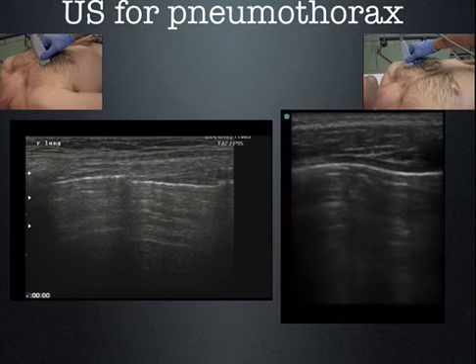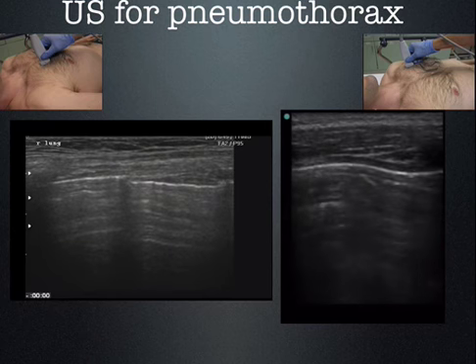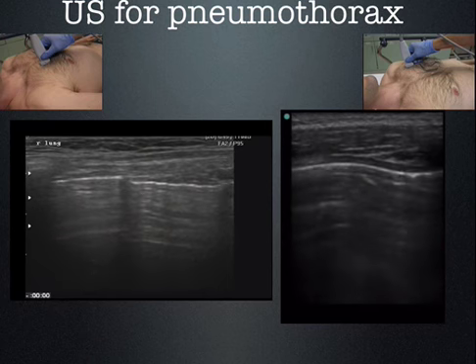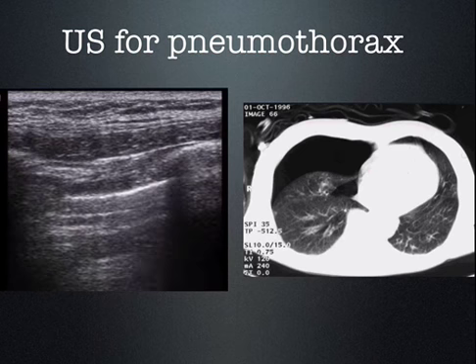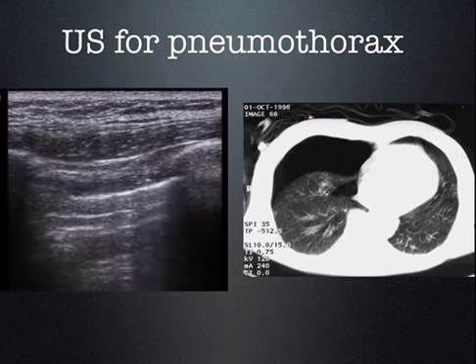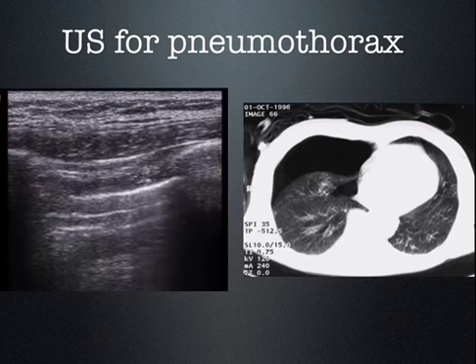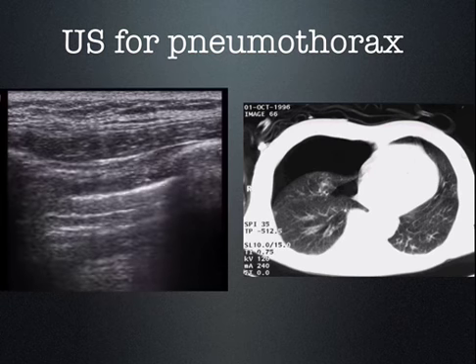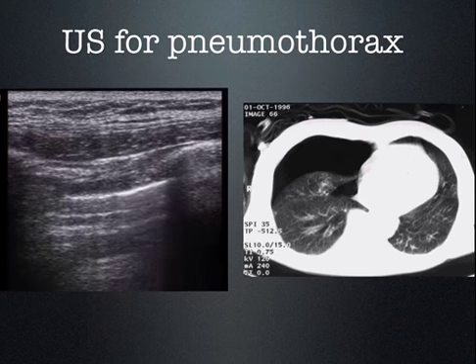Whereas if you have a patient who could have a tension pneumothorax, the clinical picture fits, and you see this, that's the side you want to needle, the right side. Okay? No sliding lung. Does that 100% rule it in? No. Remember, air collects anteriorly. If you come around this side here, you can see where the lung and the pleura are still intact. This is where the lung point is. You see how you have some slide here, but no slide here. Here, the visceral and parietal pleura are still intact, whereas here, it's just the parietal pleura. This is 100% specific for a pneumothorax.